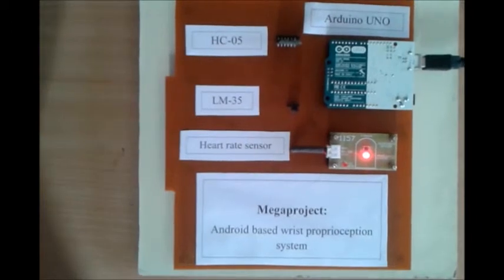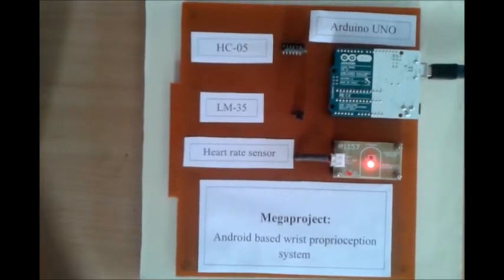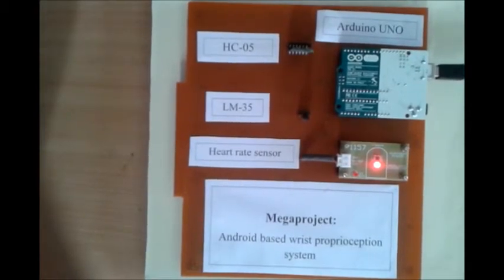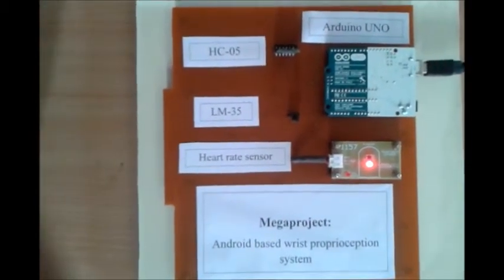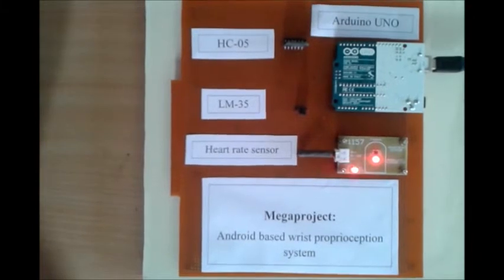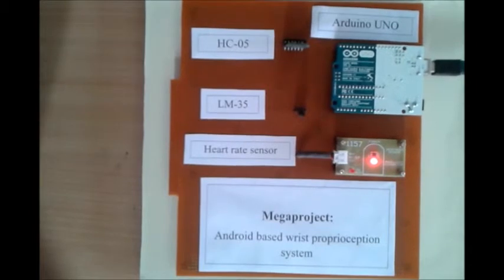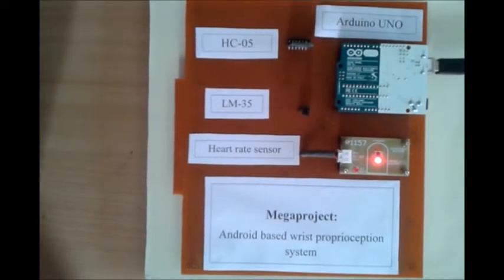Obviously the 1024 is the sampling data. Now for the pulse sensor, it is compared with a predefined threshold. When it crosses the threshold, it is checked whether it is noise or pulse. If it is a pulse, then it is stored in the variable. Also, the running signal is stored in the variable. When both the temperature and the heartbeat rate are acquired, they are fitted in a data frame. The data frame is sent over a serial port. Now the main part: this frame is sent to the mobile device through HC05. As I have mentioned, HC05 is the medium for our project. It is obviously a Bluetooth device. This frame is decoded into different body parameters which are gathered by the sensor. Those parameters are namely temperature, heartbeat and the value of the signal.